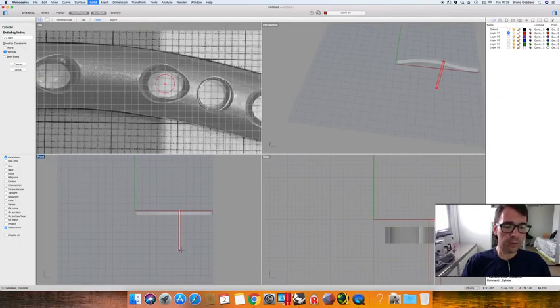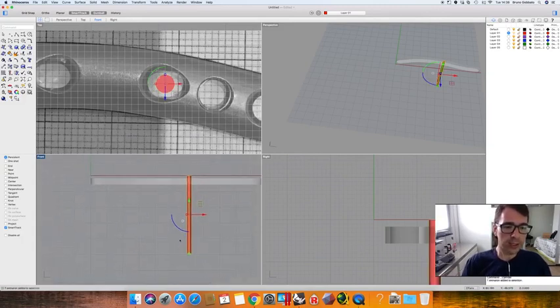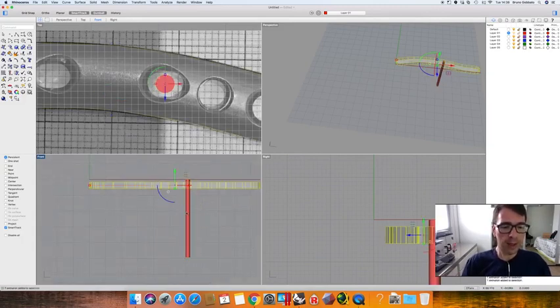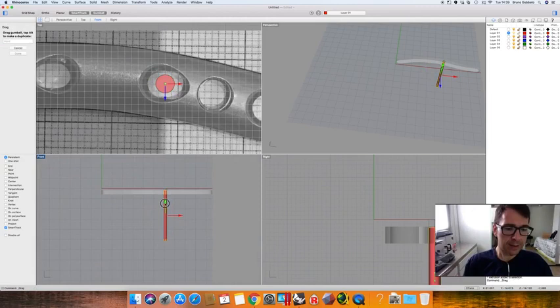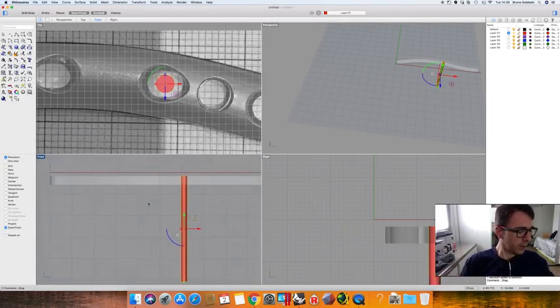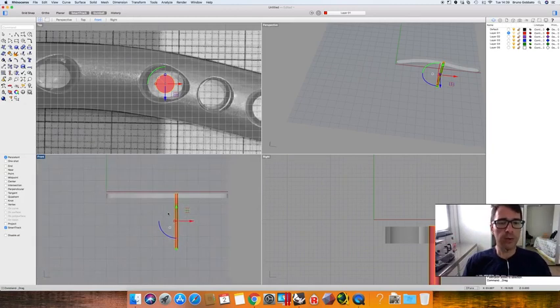We use the front view to put the screw just like that. As you can see here, we have the implant and the screw. Okay? What is a suggestion? In order to see from above and from behind, I don't do like that. This is how the plate is, okay? The plate is like that, and the screw will be above. But for me, it's more important to view the screw from all the views.